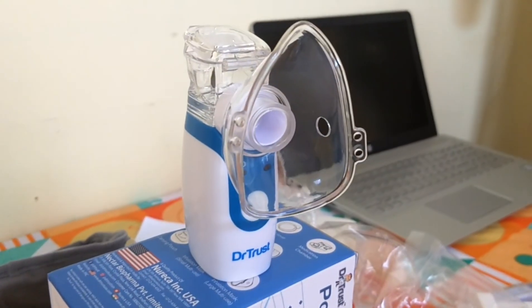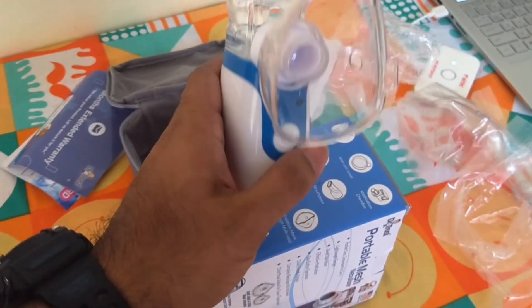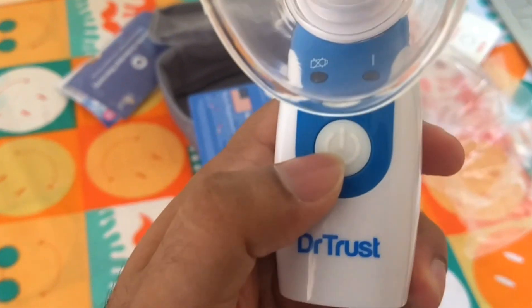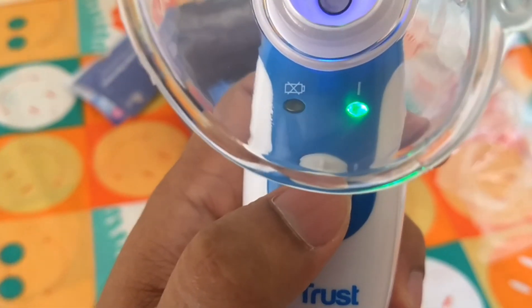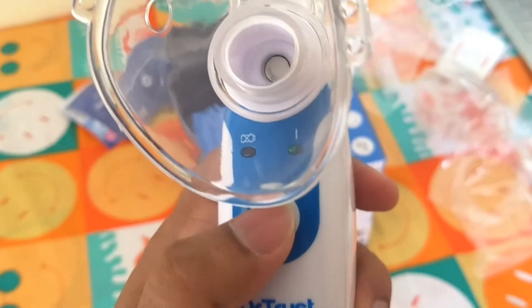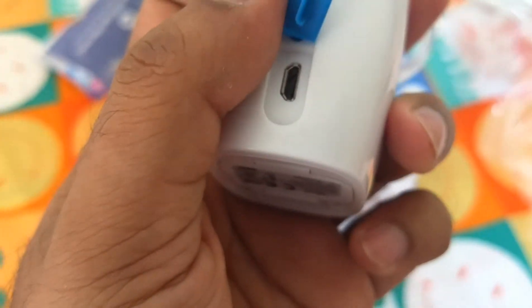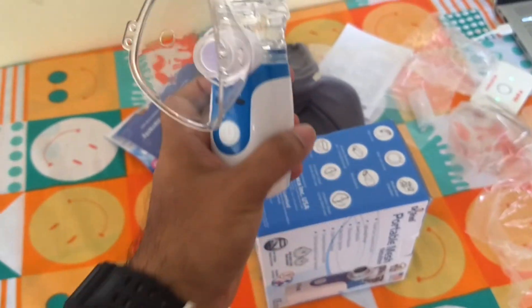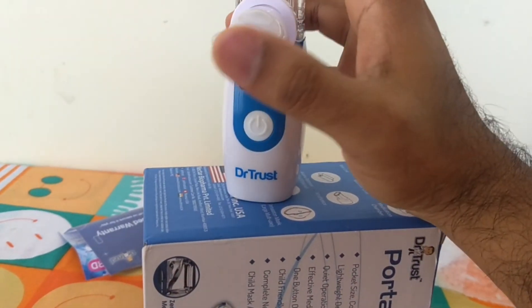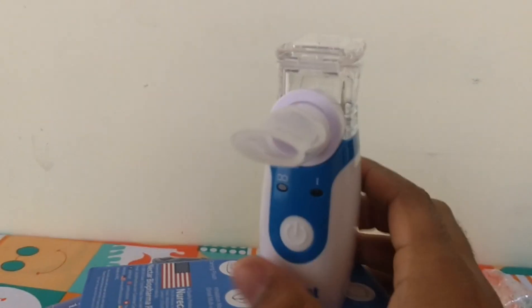Look at this — it is very small when we compare it to other nebulizers. We can say it is a pocket-size nebulizer. When we switch it on, we can see a light. Here is the USB connection port. The mouthpiece is used to inhale directly through mouth.